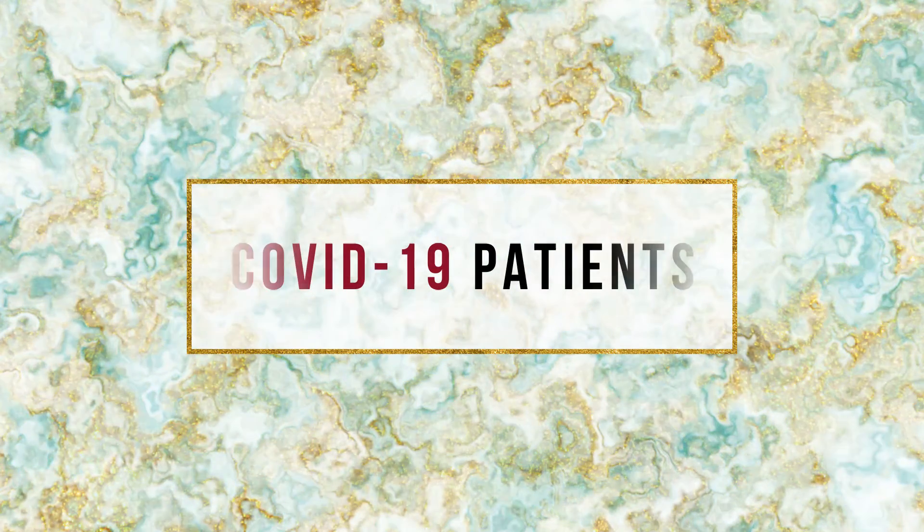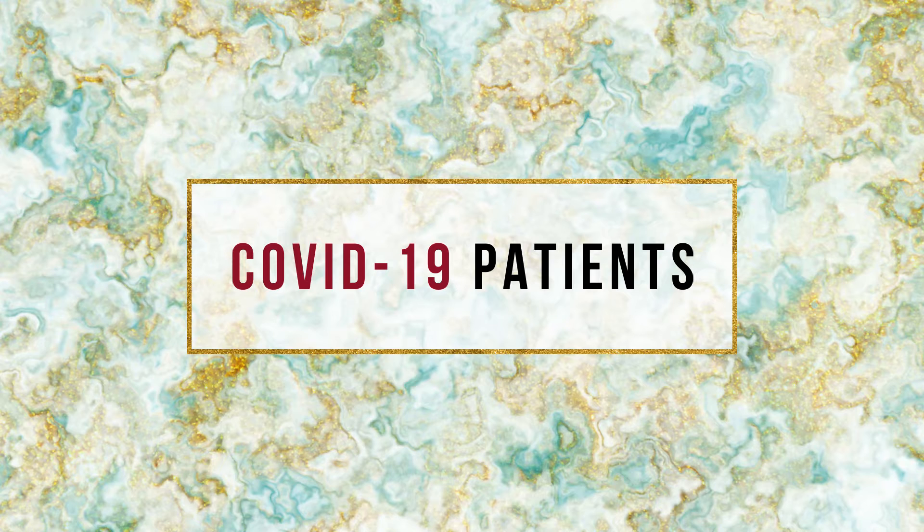This video is a demonstration of techniques that can be used to intubate patients with a suspected COVID-19 infection. It's been produced by Dr. Lucas Kandler, who is a consultant anesthesiologist in Zurich.